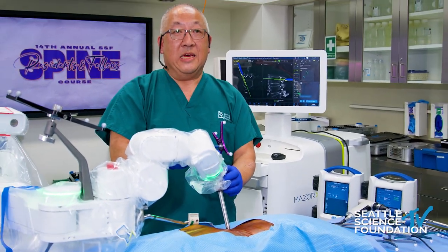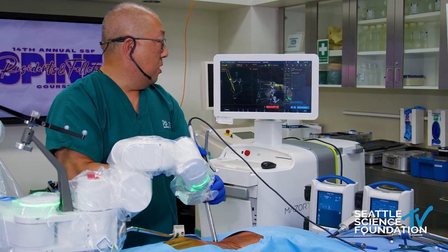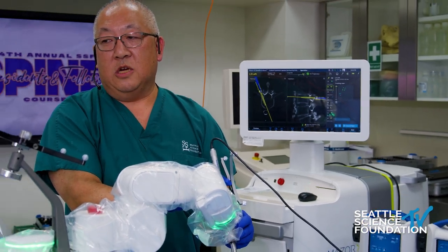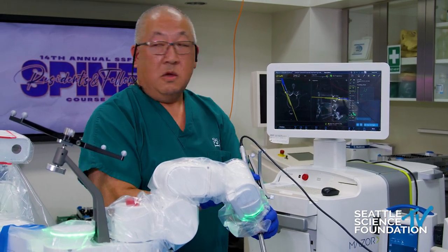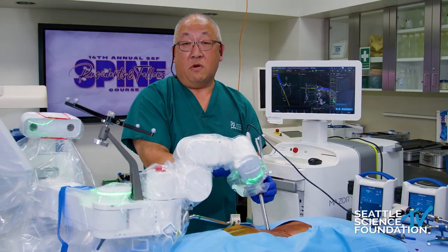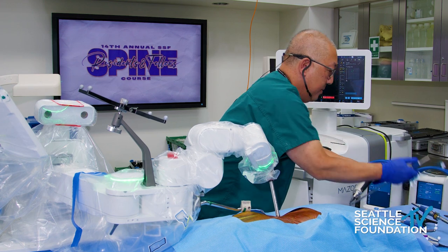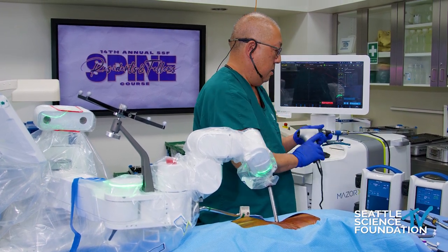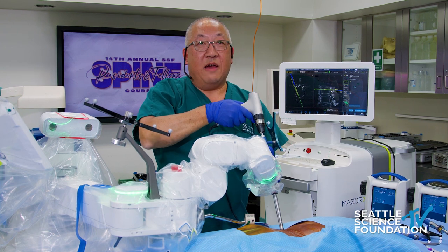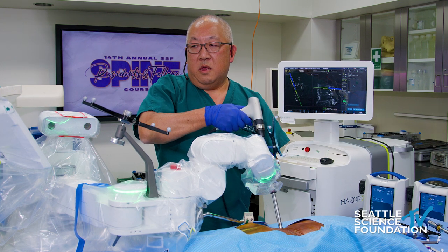We leave the cannula in and take the dilator out. We go with the Mazor Midas and look at the screen to verify the position of the live instrument in comparison to the navigated screw, which you can see on the back screen. I'm going to pull the drill back and create a pilot hole. That pilot hole has a depth stop of 30 millimeters so you can't plunge. We take the Midas out, switch it over to a tap, and go with a navigated tap through the cannula. Again, I verify my navigation by looking at the screen and tap the pedicle.